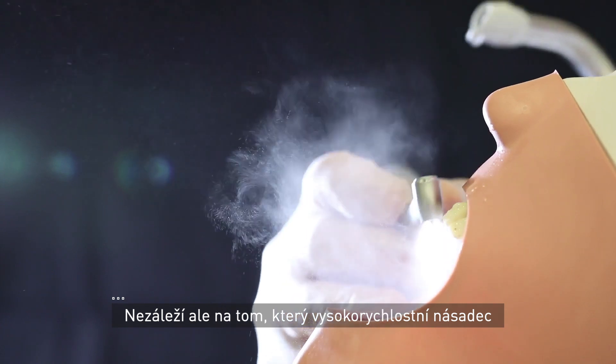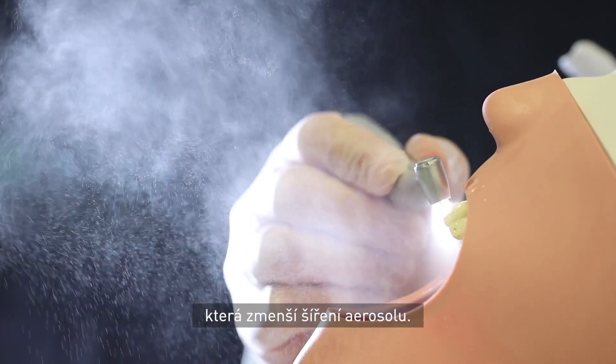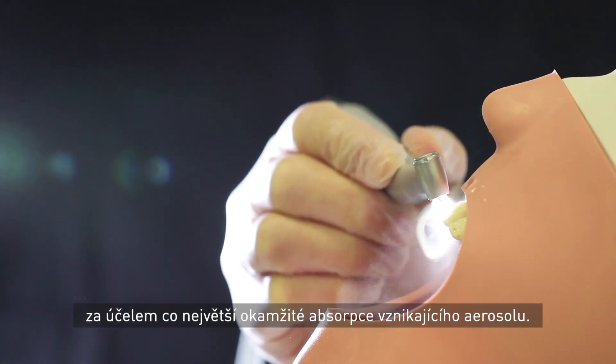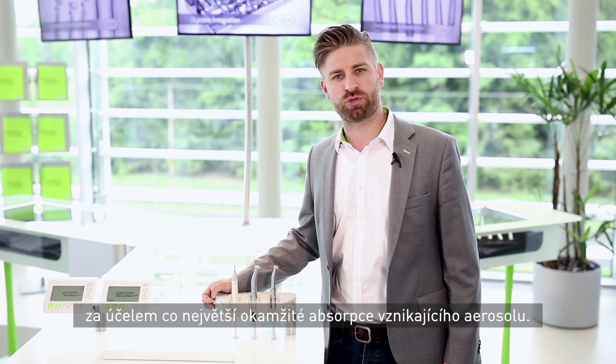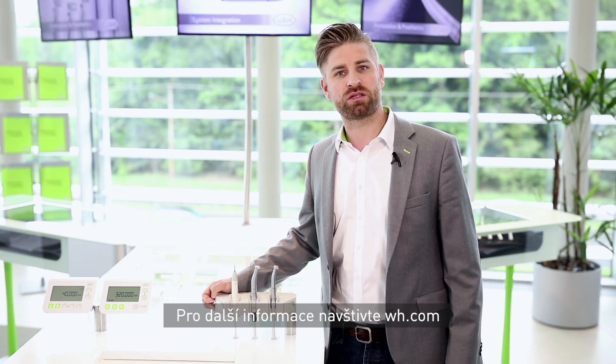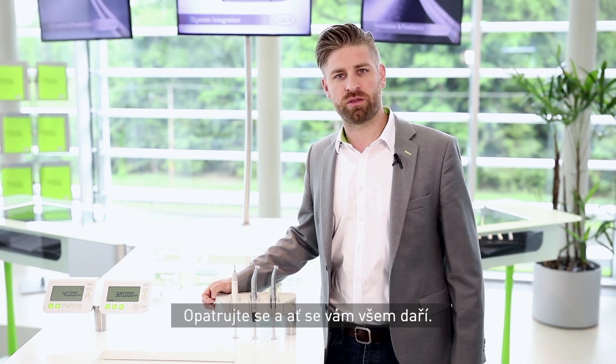No matter which high-speed handpiece you finally decide to use, there are many measures to reduce the risk of aerosols, like the use of suction to achieve best aerosol absorption. For further information, visit us at W&H.com or contact us directly. Stay safe and all the best.